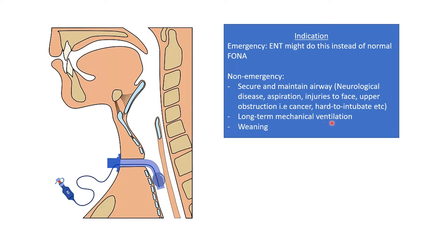It's also if you have someone who is in the ICU for a longer time, then it's a better solution than the tube. Especially if it's decuffed, because when it's decuffed, then it's not pressuring on the tissues. So in general, it should be decuffed for most patients in the longer term, because there's more benefit for the patient if it's decuffed. It's only usually in emergencies that we would like to cuff in some situations.